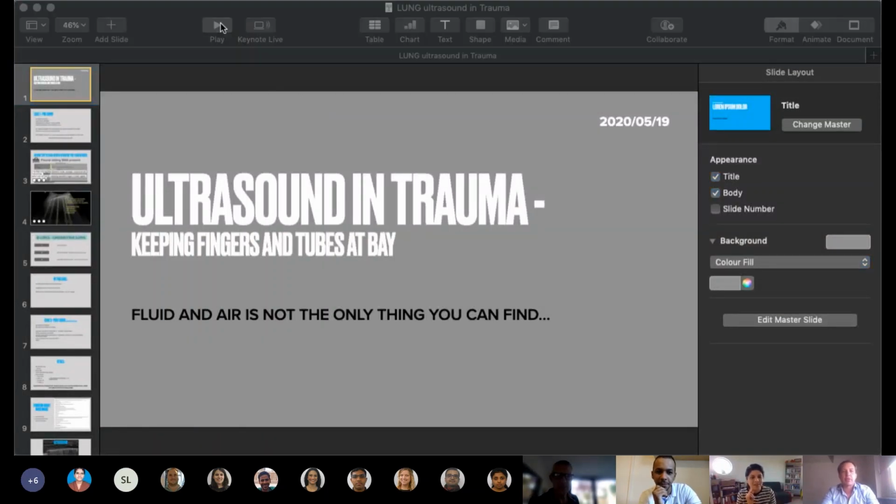Like I said before, I'm super glad it was a very good presentation from Yasir and his approach to the pleural and pneumothoraces. So the two cases I'm going to speak about were where it was difficult to enforce your findings, and I completely agree with him about the supine view in trauma. Waiting for that X-ray to make a decision with or without an unstable patient is really going to miss many.